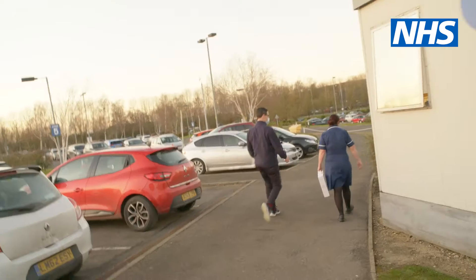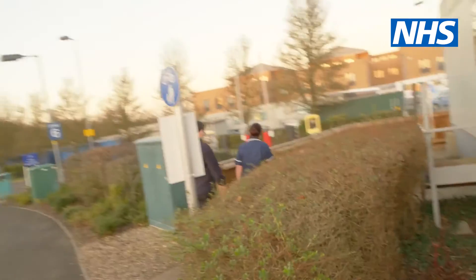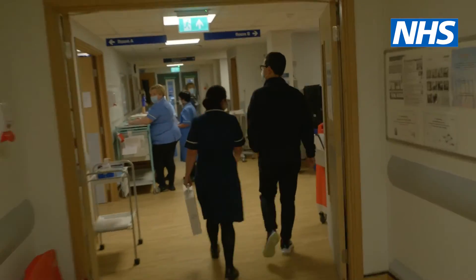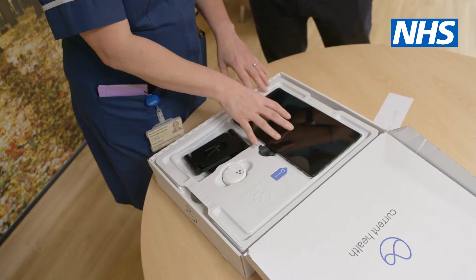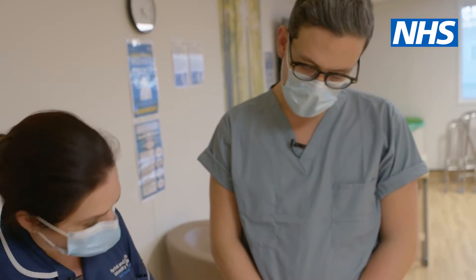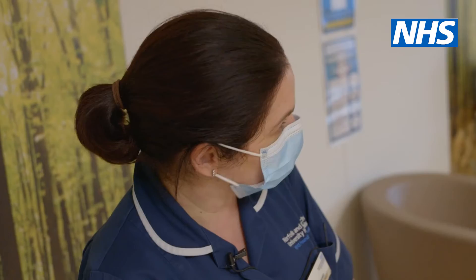My name is Claire Beard. I work at the Norfolk Norwich University Hospital. I am the ward manager of the virtual ward team. So this is the basic kit that the patients go home with. The first thing they do is turn the tablet on, and when it is on it will give them a couple of different options — it will say 'set up' or 'calibrate'. They press set up and it will step by step tell them exactly how to set the kit up.